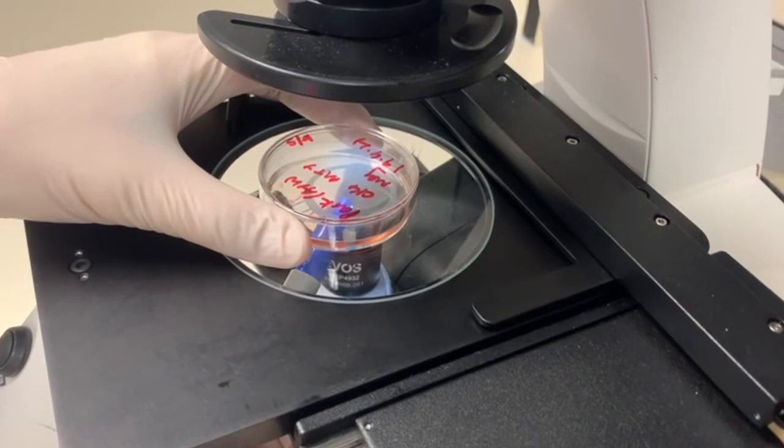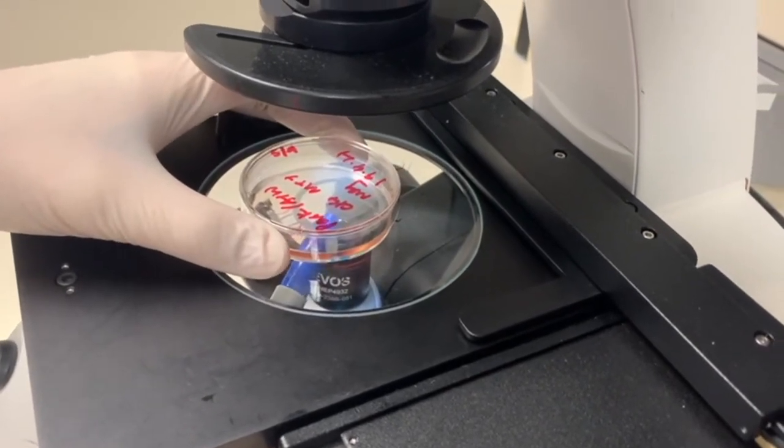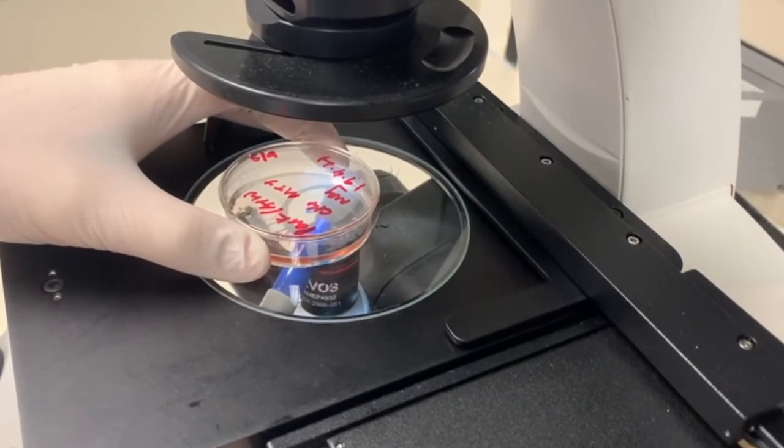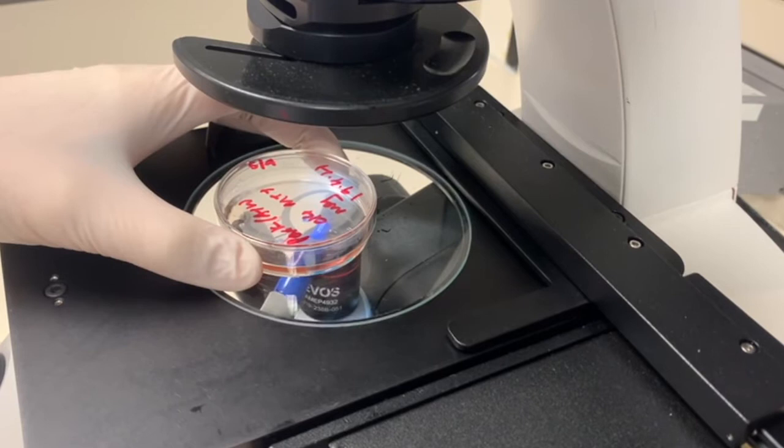Using 4x magnification, look for spontaneously differentiated cells within the IPSC culture. The low magnification makes it easier to scan the plate in an efficient manner.